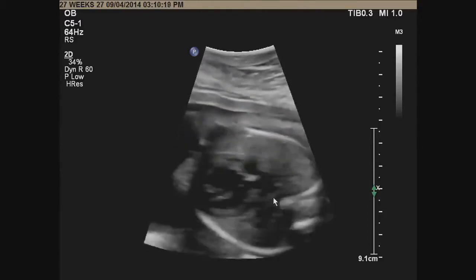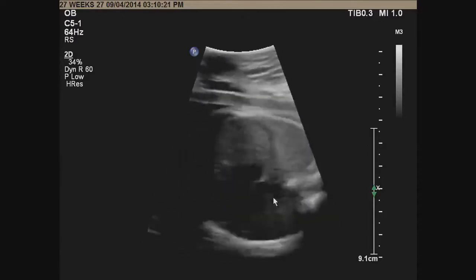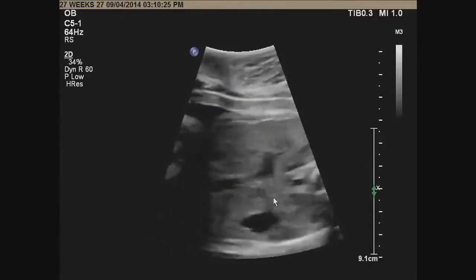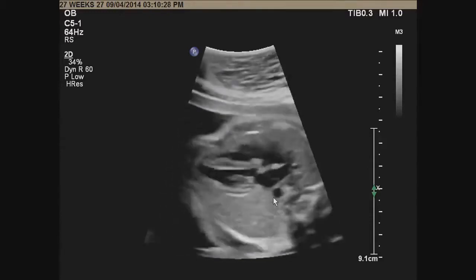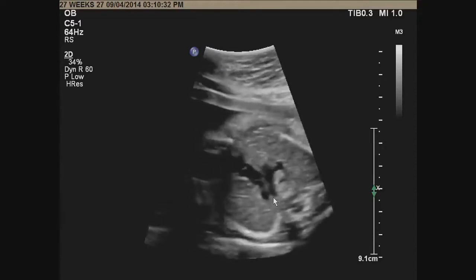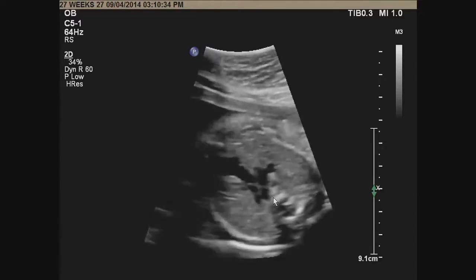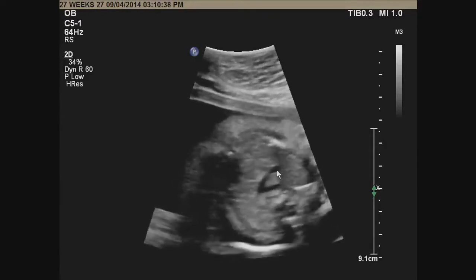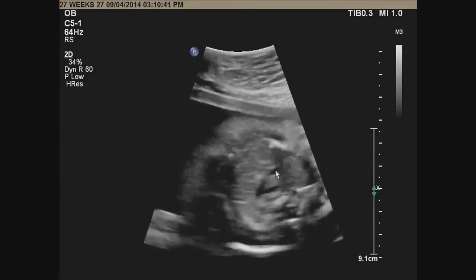And so it's really important when you look at the heart, whether you're doing screening or you're doing your echo exam, that you look at all these important structures around, because it can give you a lot of suspicion for the presence of an abnormality here. And here you actually see the brachiocephalic vein dumping into the superior vena cava. So I'm very, very high in the chest.